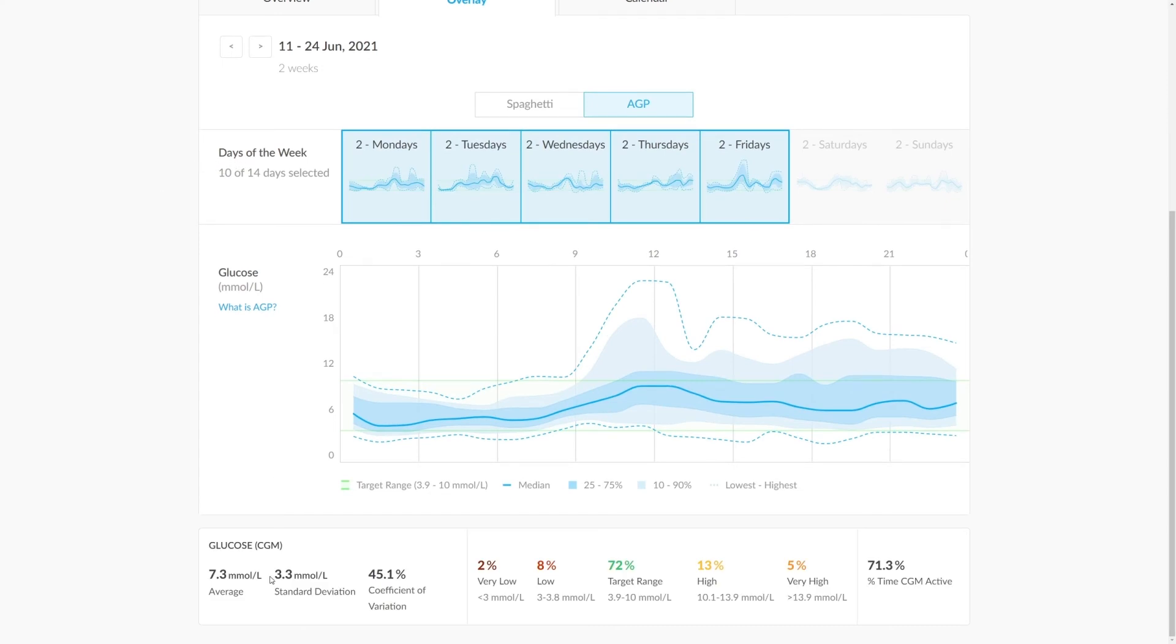You'll see how these adjust depending on the days that we have selected. As with other areas in Gluco, the glucose values are broken down into very low to very high brackets.